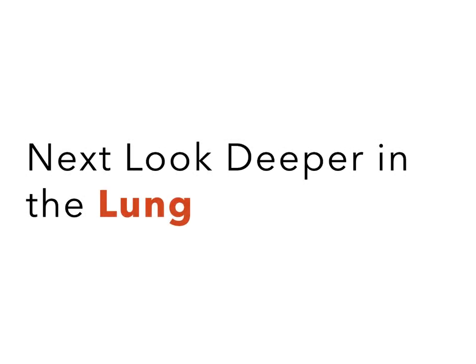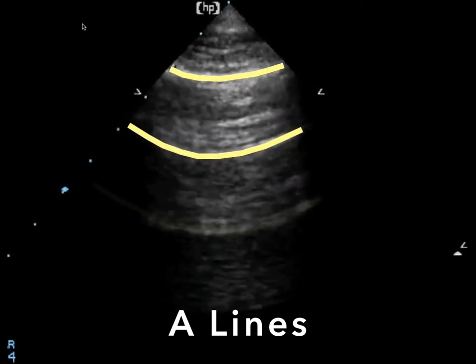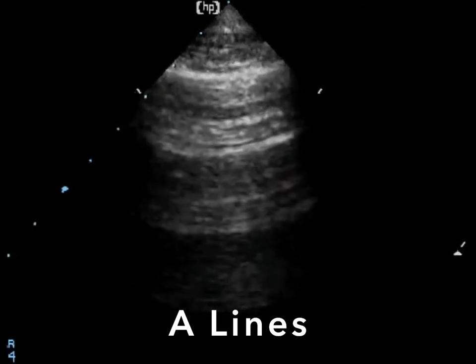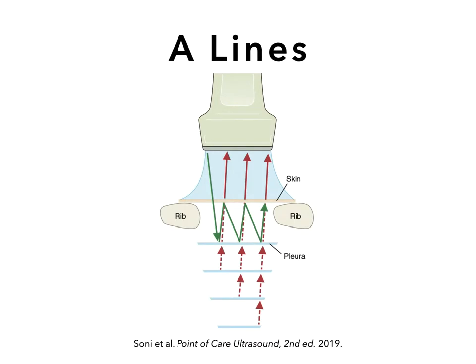Next, look deeper in the lung — adjust your depth to at least 14 to 16 centimeters. Normal lungs should appear to have multiple horizontal hyperechoic lines descending deeper into the screen. These are called A lines and indicate normally aerated lung provided there is normal pleural sliding. A lines are a reverberation artifact — they develop because the pleural line is a strong reflector of ultrasound waves. The wave is reflected to the skin, then back into the chest, then back off the pleural line repeatedly. The ultrasound machine interprets time as distance, so subsequent reflections appear as deeper and deeper horizontal lines on the screen.